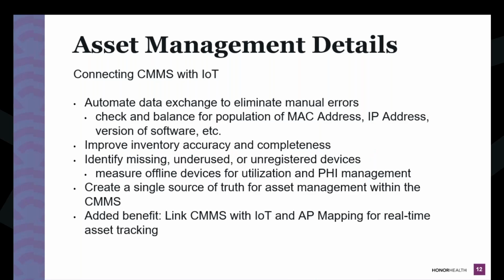So there were changes in our CMMS system at the time. So a lot of that is attributed to just cutting over systems and just not having all that information. But now today, our last report, we had 5 devices that had PHI that haven't been connected to a network in 60 days. Doesn't mean that they've left our organization, right? They could be in Nurse Betty's closet for all I know, right?